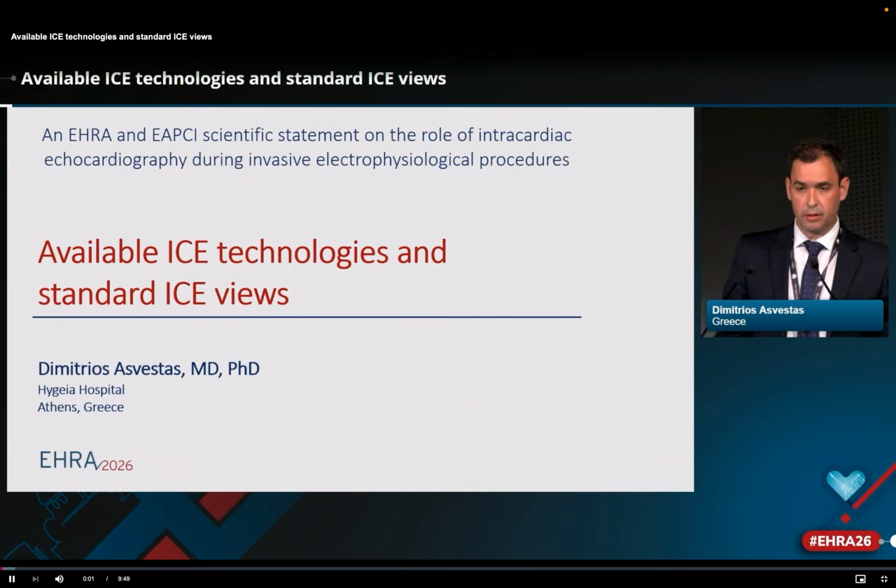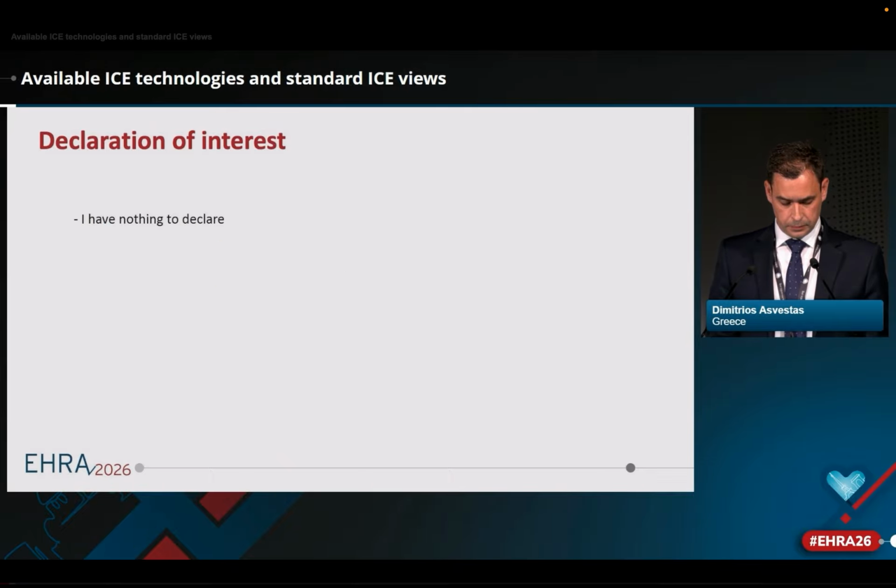Today I will present available ICE technologies and standardized views.